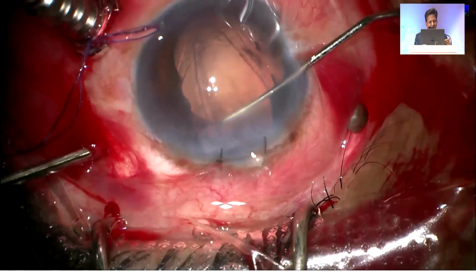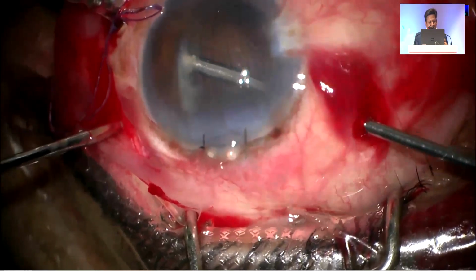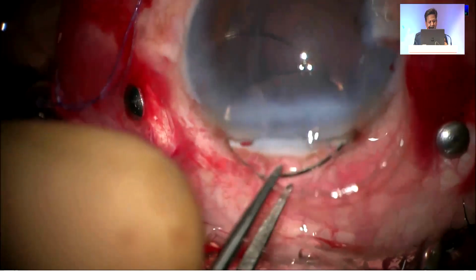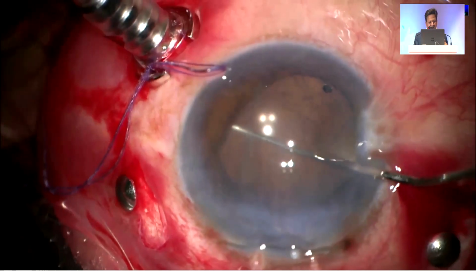And here you see when we started the infusion, the incision was leaking. There was vitreous still in the wound. And we have to take care of this: remove the vitreous, remove the remaining lens matter, put in a lens, and then we have to push further for the vitreous surgery.